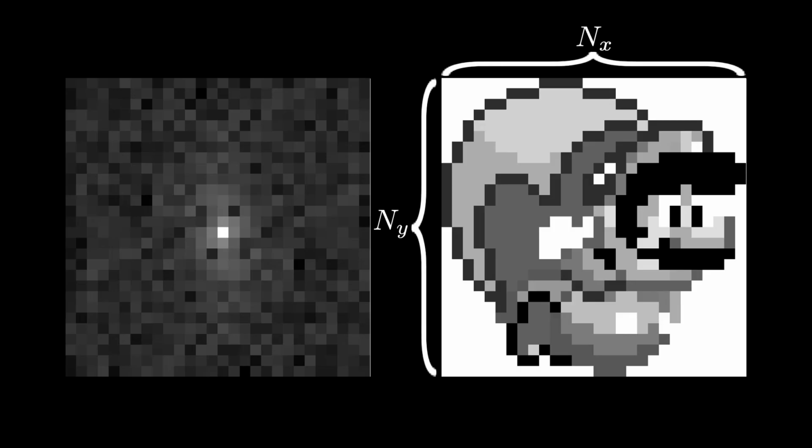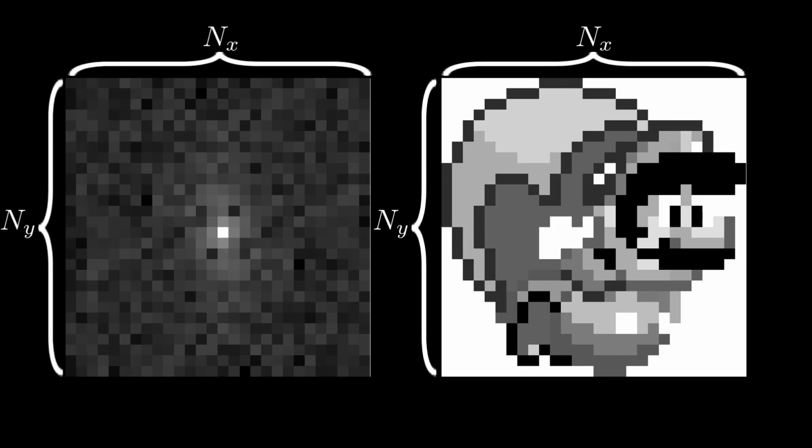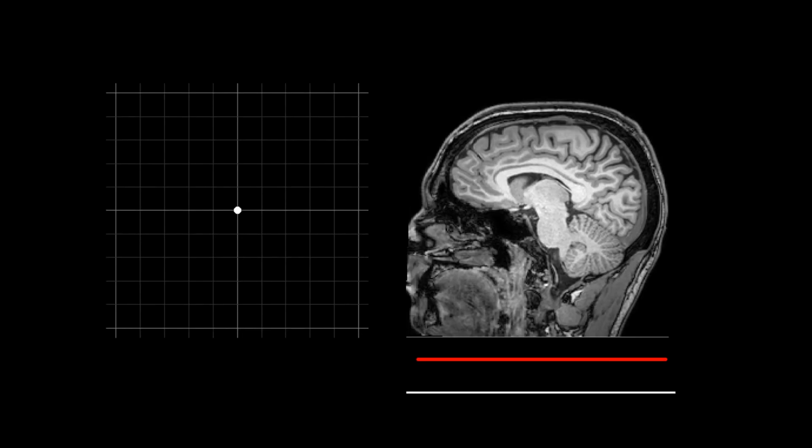Now perhaps we should return to the question, what are the units of k-space frequencies and how do they relate to images? Well, just like in the 1D discrete Fourier transform, the number of pixels in the image is the same as the number of points in discrete k-space. Also, in the discrete Fourier transform, discrete k-space frequencies have units of cycles per field of view. And now perhaps it makes some sense why I picked this nomenclature earlier. The image has specific dimensions in x and y corresponding to physical distances, which our image covers, our fields of view, in x and y.